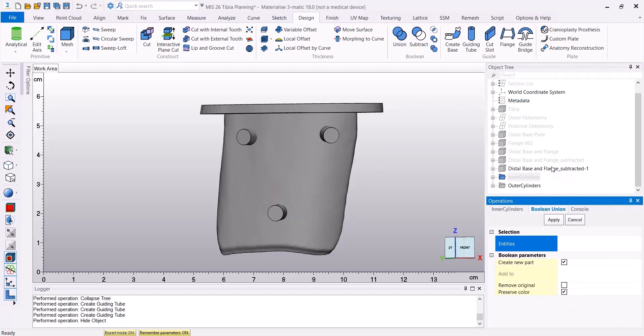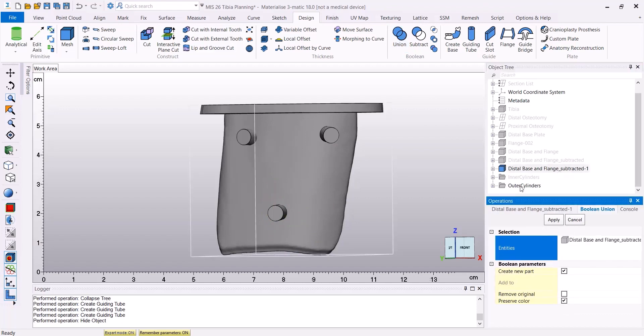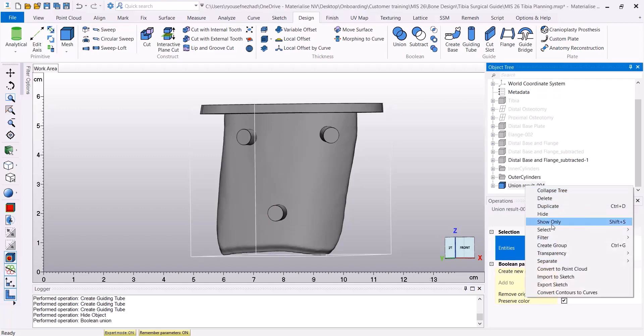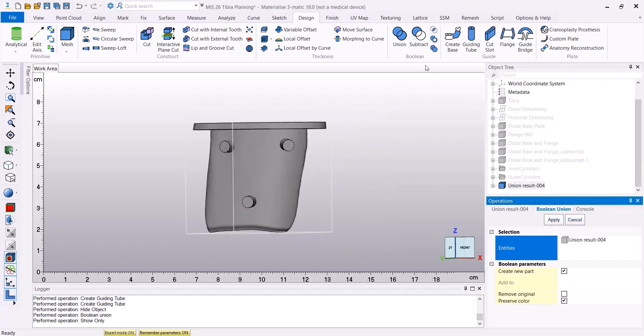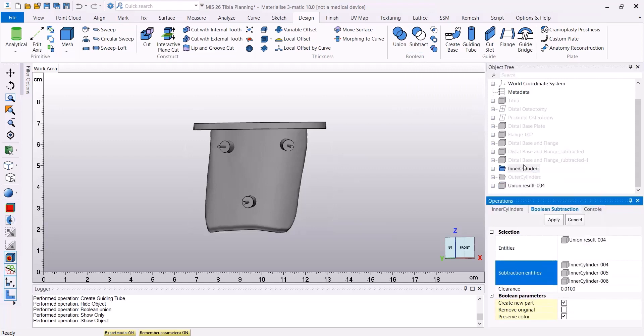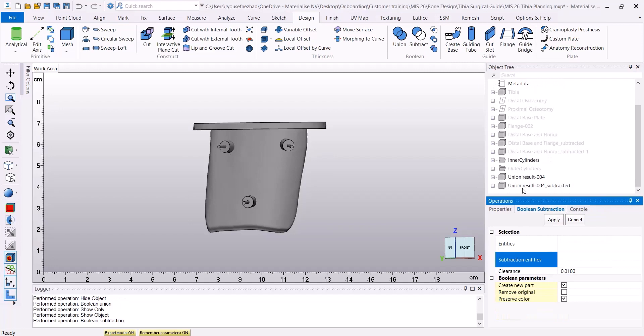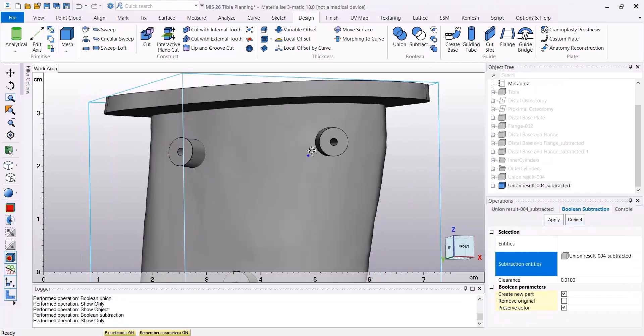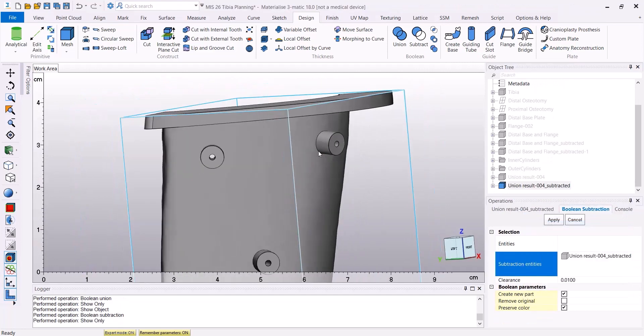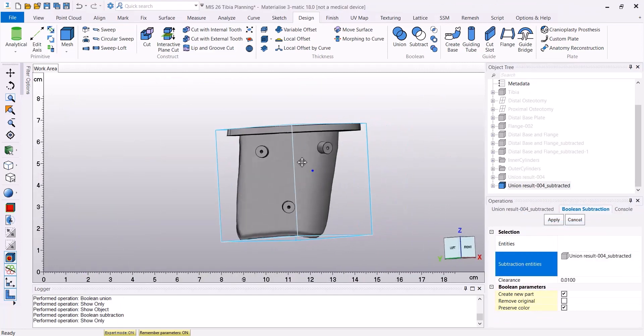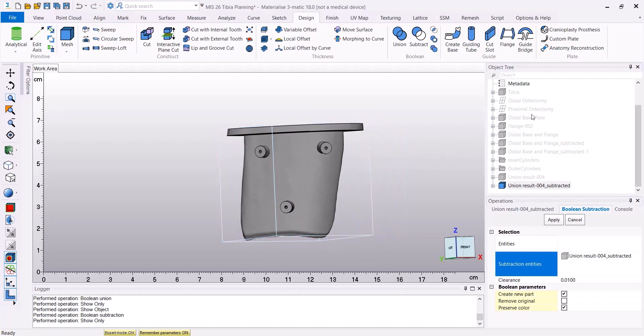Using the Boolean union, we're going to create our base with the outer cylinders. And using the Boolean Subtract, we're going to subtract the inner cylinders from our base. And this is the final result for our Distal Guide Base.